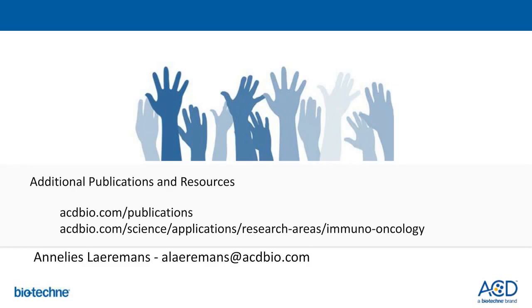So V1 is mostly for fresh frozen, and if you want to move to FFPE tissues, you can definitely use the V2 assay. Or if you, for instance, have a low expressor or tissue that might have high autofluorescence, we also recommend to use the V2 multiplex fluorescent assay. Can dual ISH IHC be performed on an automated machine? Yes, for sure. We have the Leica Bond RX, and also now we have the Ventana Discovery platform. These are two automated platforms that can be used to run the multiplex fluorescent assay.